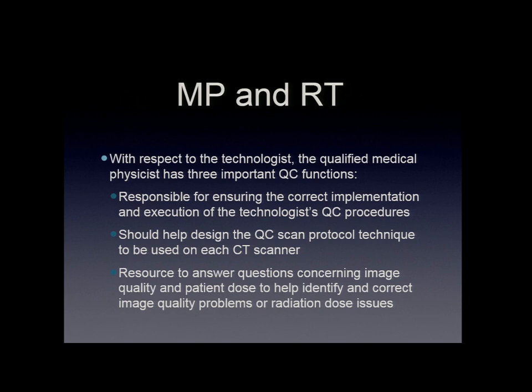And so not only do they establish it, but then they have to make sure that they're working together to make sure it's properly executed. Our sites will send us copies of their QC on a quarterly basis, so that we can see things more than once a year, and check that they're not outside of the control limits.